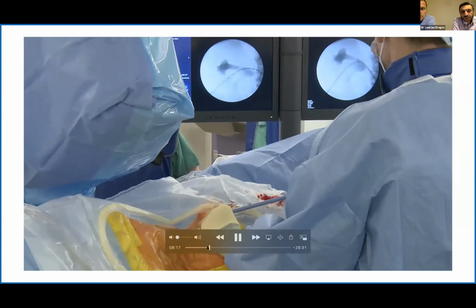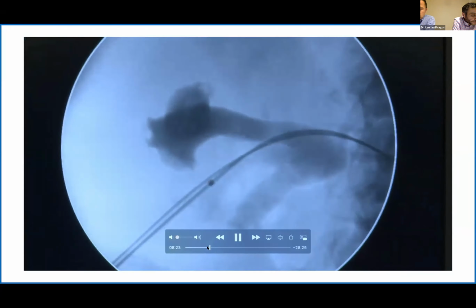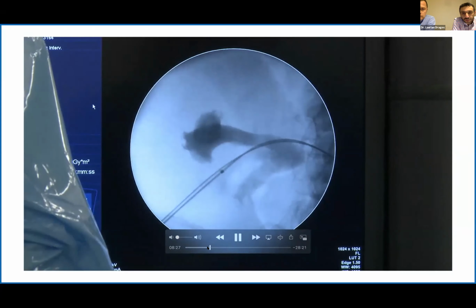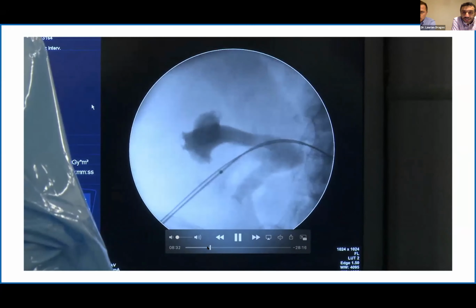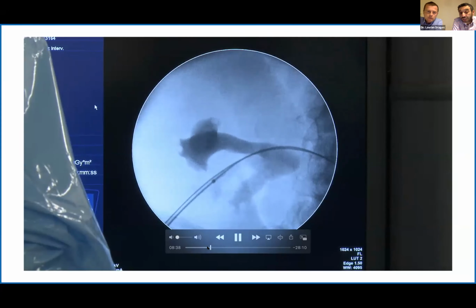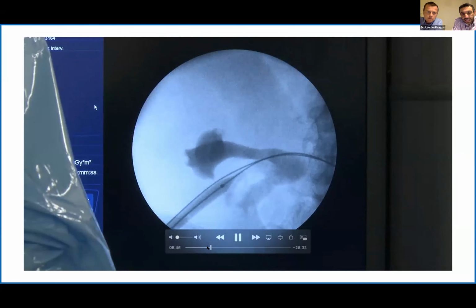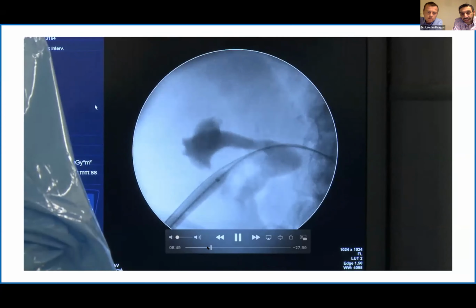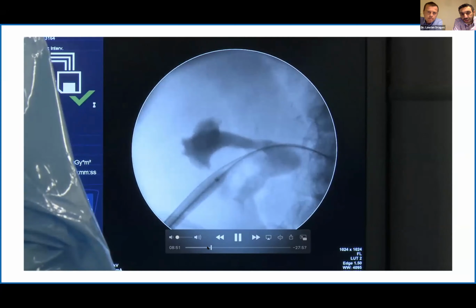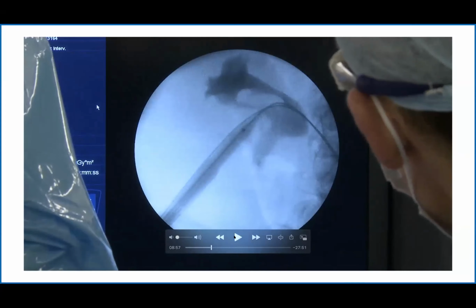So here in the process of trying to achieve our dilatation, there's lots of debate about whether we should use balloon dilation or whether we should do serial dilatation. We tend to favor balloon dilatation, particularly in this case, but we can discuss that later on as well. As you can see, having got the contrast in the balloon, we can see the nice dilatation of the tract, and we're almost ready to start the procedure. Kasra, I wonder, can we just pause the video for just a second?